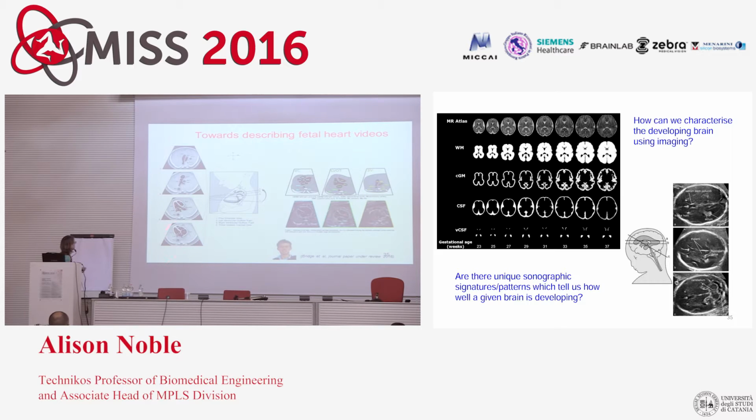And they also have a slightly different anatomical structure as well, because there's a part of the chambers that join up post-birth. But basically, you've got the same issue you have with adult cardiology, that the person who's checking the heart, checking its anatomy, is expected to make tiny little movements to be able to get views that might look like this. And as you see here, they are very much blob detectors and context-type blob detectors.